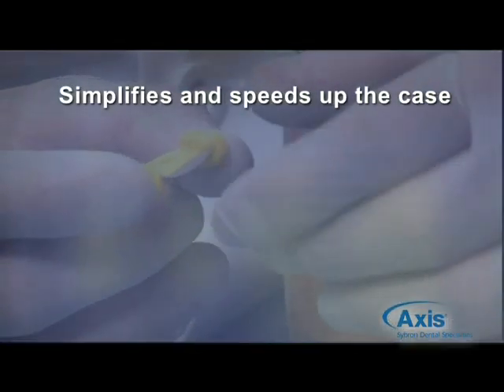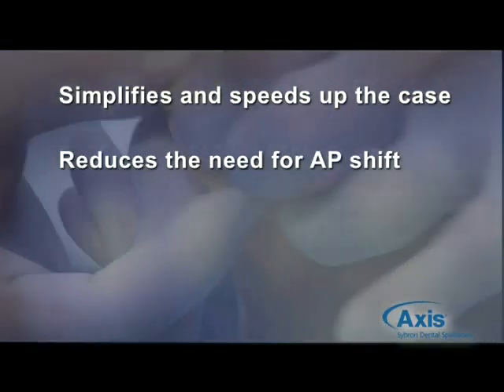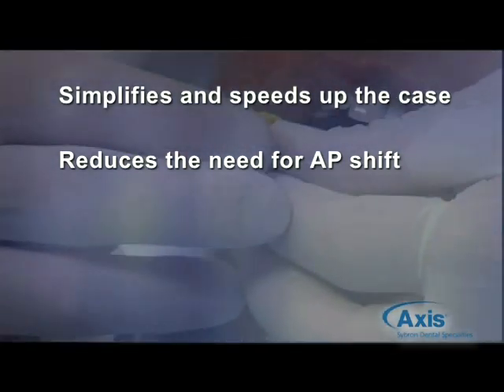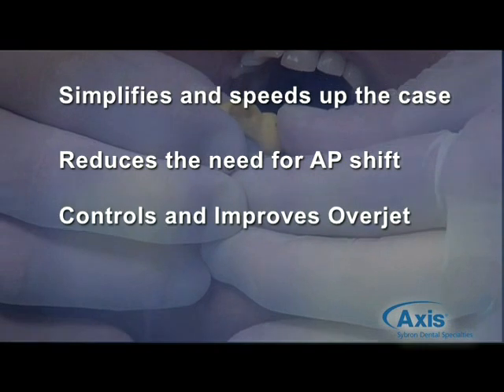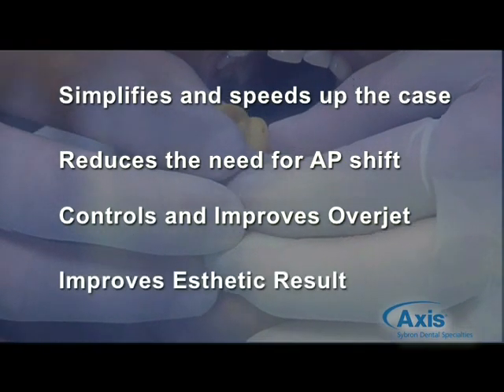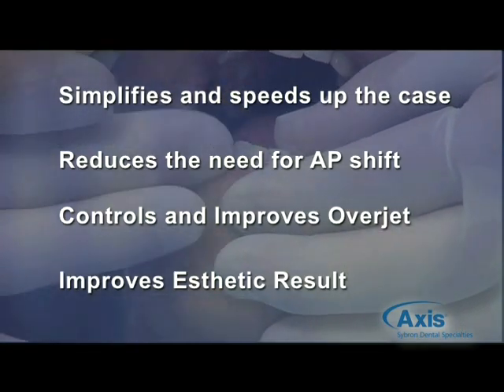Not only that, Brian, but there are some other really good reasons not to leave IPR out of the mix. IPR simplifies the case and often speeds it up. It reduces the need to move the molars, and it increases, as you've said, the stability of the case. IPR controls and improves the overjet, and it can improve the aesthetic result of any teeth.